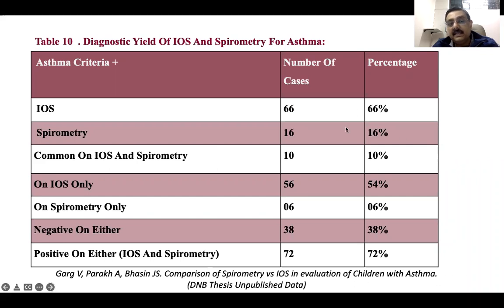Spirometries were quite less, the diagnostic yield, right? And if you add them together, then the yield is significantly high, something like 72%, right? So what we have gradually learned over time is that because we do it in the same equipment, the same software, we tend to use both these modalities together, and they give us additional inputs on what's going on with the patient.